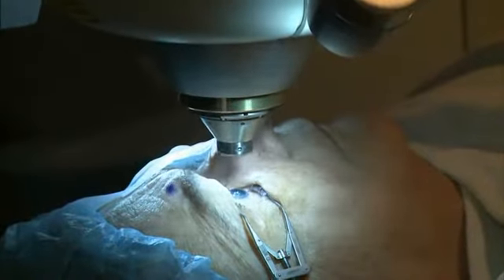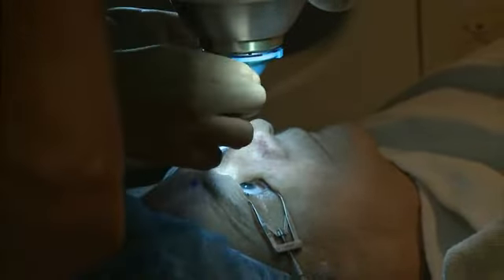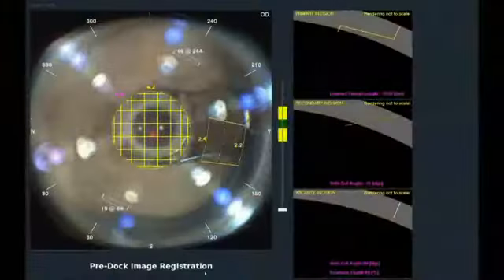Let's go ahead and add the patient interface. Another drop — artificial tears.